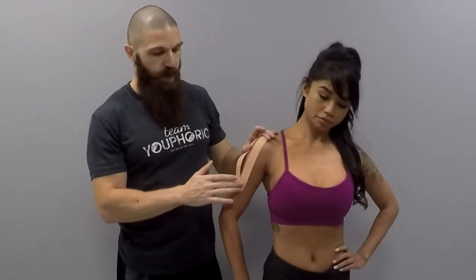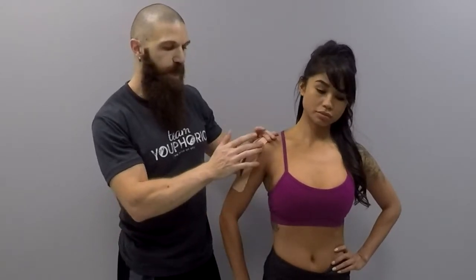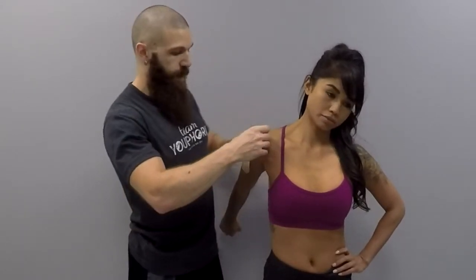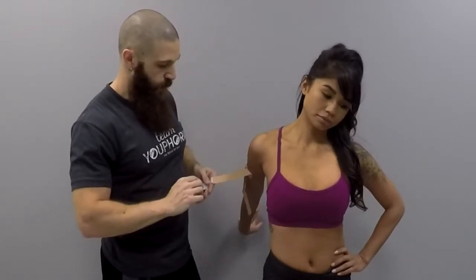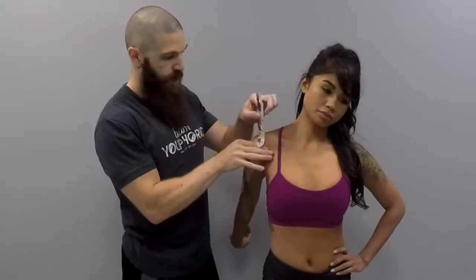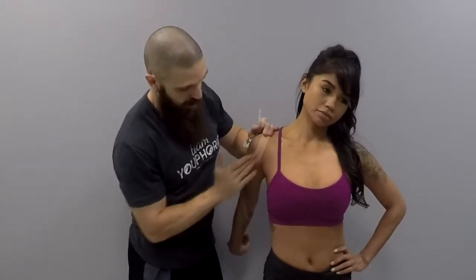You are going to put two inhibition strips. For this one, to inhibit the anterior deltoid, what we are going to do is have the client reach behind their back. Once they've reached behind their back, with very light tension, you are going to trace the anterior deltoid and rub to activate the adhesive.